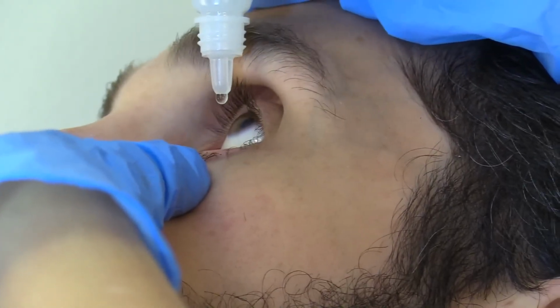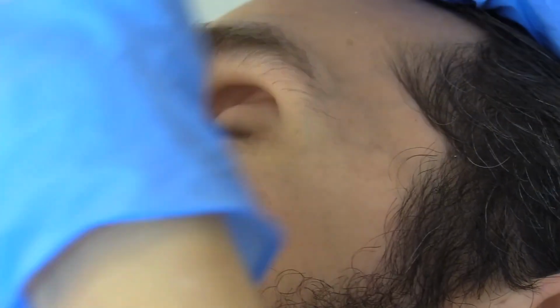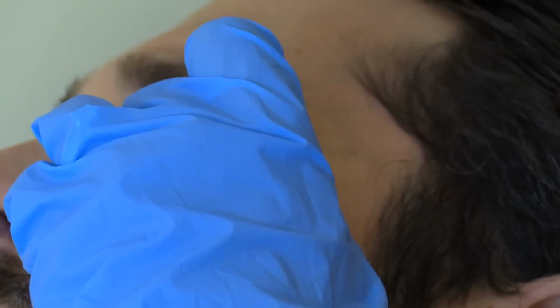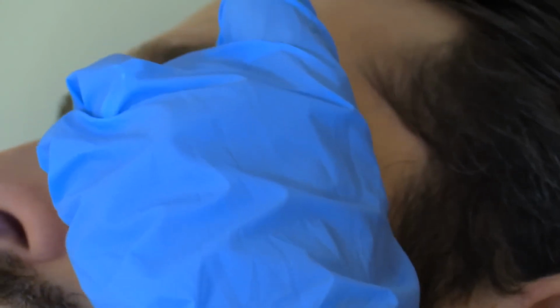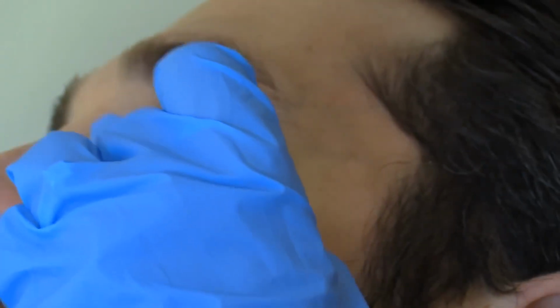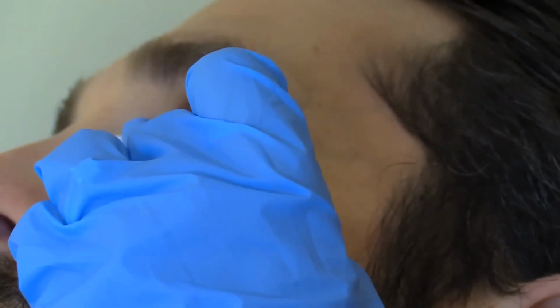1, 2. Okay, and then the patient's going to close their eyes and you tell them to roll their eyeball around to coat the eye with the medication, and dab the eye with the tissue paper to collect any excessive drainage.